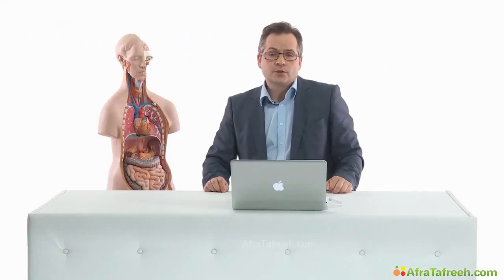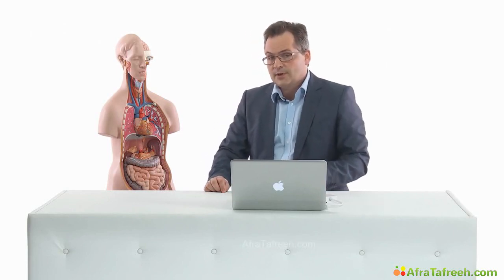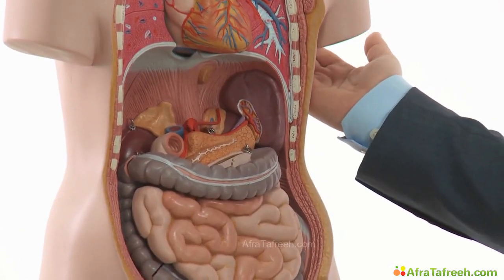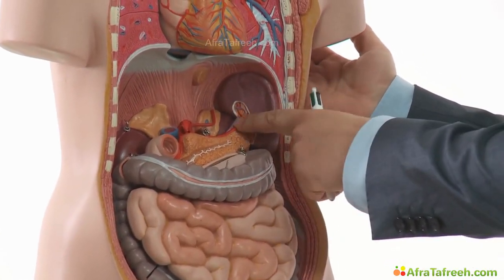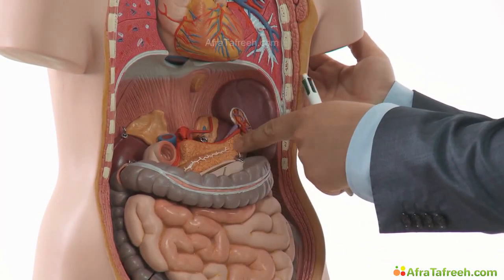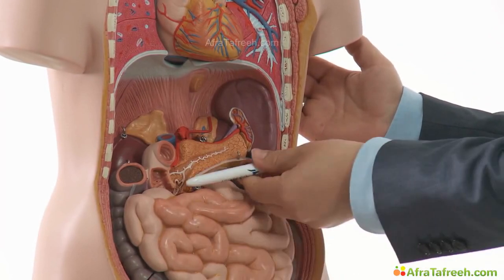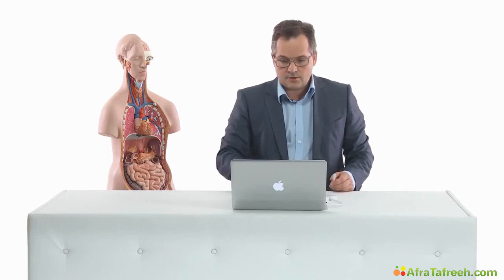We have another opportunity to scan the tail of the pancreas. We are looking for the splenic vein in the hilum of the spleen, and the pancreas is located lateral to this vessel. So we scan in a left lateral position, in between the ribs in an intercostal space, and scan the spleen, its vessels, and when we get the splenic vein, we see pancreatic tissue beside. So I'll take this away and you see pancreatic tissue over here by scanning from a left lateral position. Showing you this over here.